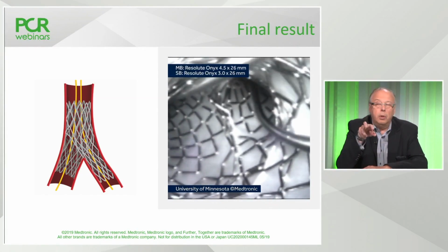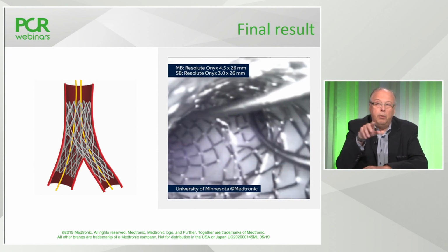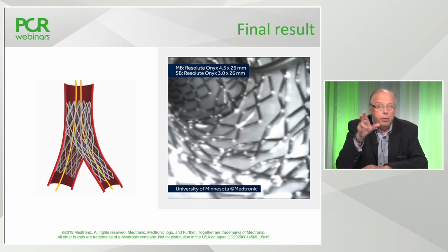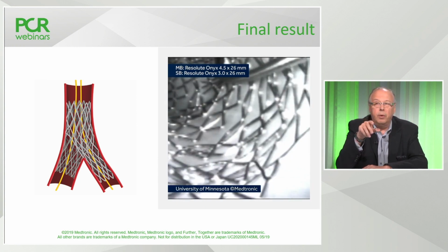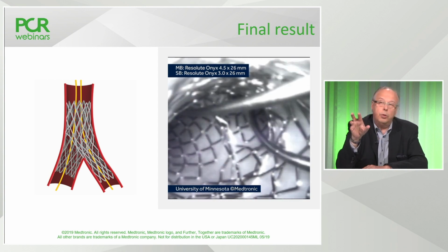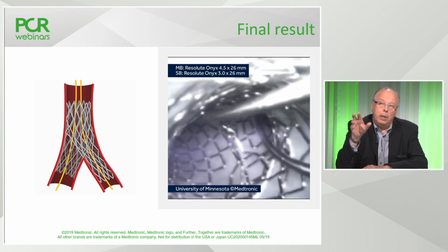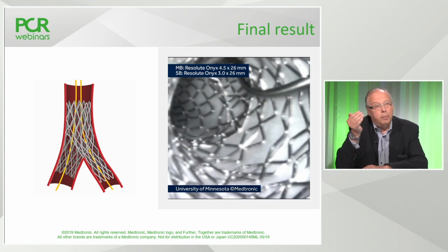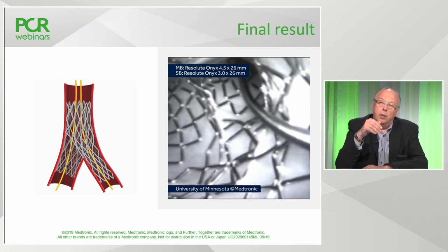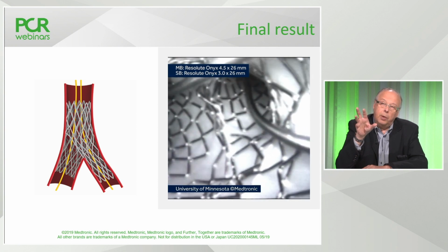Yes, I think we see very well what is, in my opinion, the main advantage of the technique, which is the quality of the coverage of the two ostia, of the carina. You can see very well the carina with a nice coverage, no overlap of the stent at this level. We see that, of course, we have probably a little bit too much overlap in the proximal part. Yeah, unnecessarily. Probably really don't need that in this case. But I think it's a very nice example, and I'm very happy to see that.